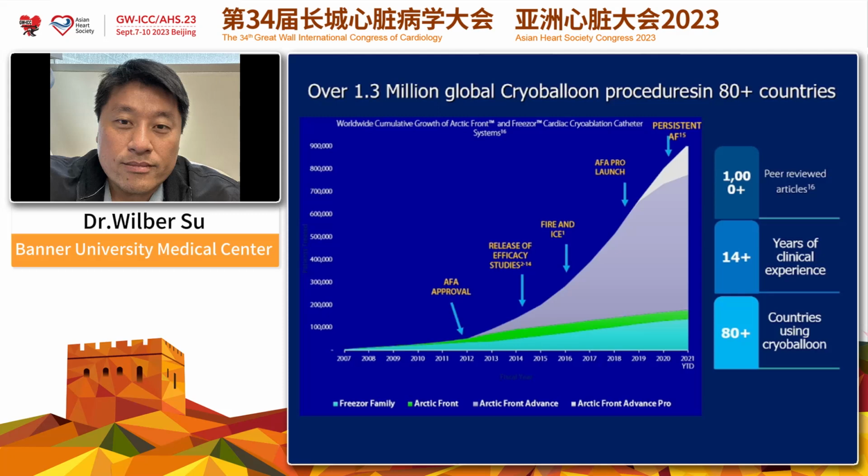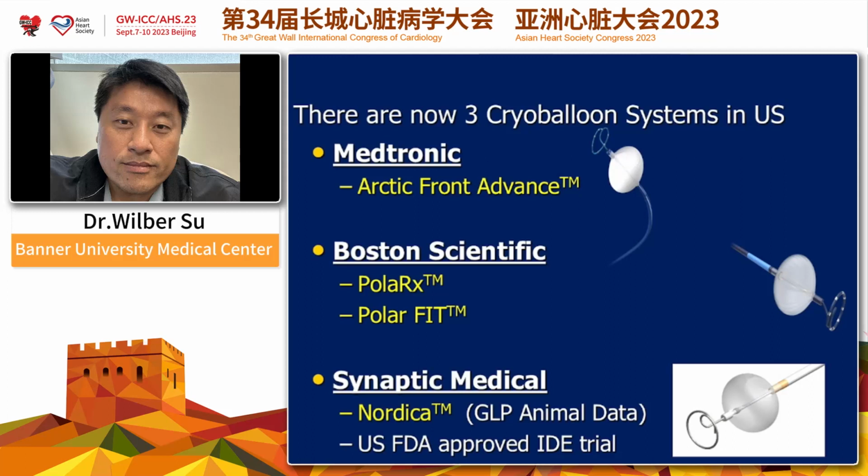It's over 1.3 million cases done over 80 countries, and there's a lot of literature on this as well. At least in the United States, we now have three different cryo balloon systems we can look at. I understand in China there are a few more, but they're fairly similar. Of course, the very first one was originally from CryoCath, acquired by Medtronic, and after a few iterations, it's now called Arctic Front Advance.